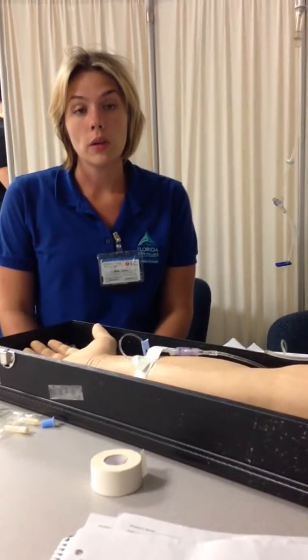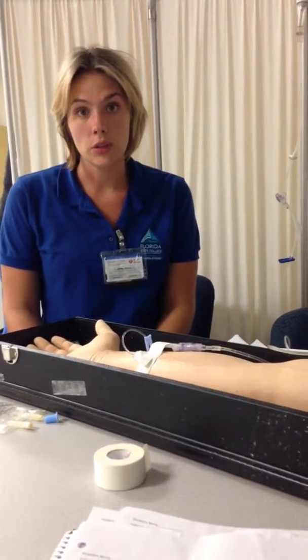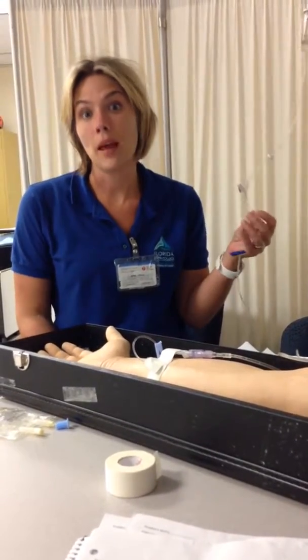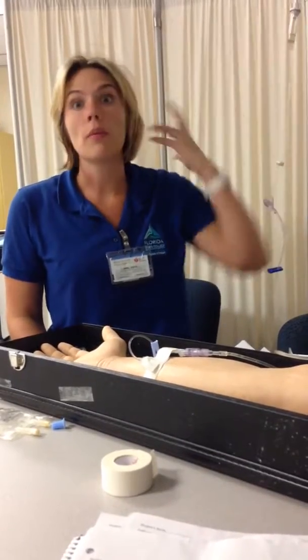April Cook, Adult Health 1, Term 2, Section 2: mini bag and IV administration, in addition to piggyback, in addition to a primary bag.